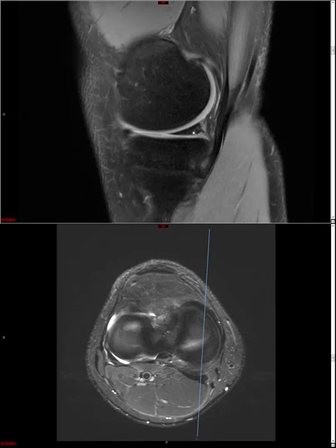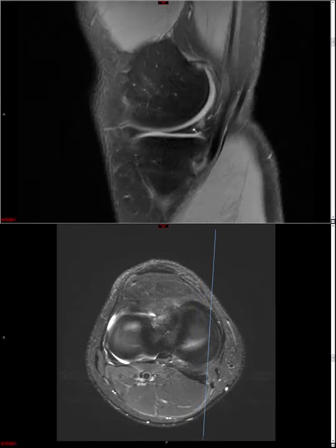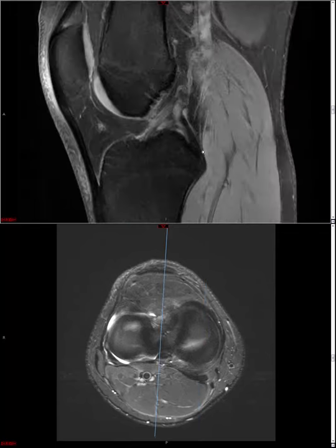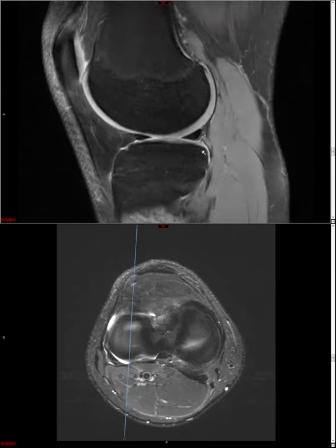Is it one of these kind of longitudinal or oblique tears, or is it a radial tear, as I mentioned previously? We should also note, too, if it is in the central two-thirds of the meniscus, the so-called white zone, which is relatively avascular, implying poor potential for healing, versus the peripheral third red zone, where there is theoretically a higher chance of healing of the tear.